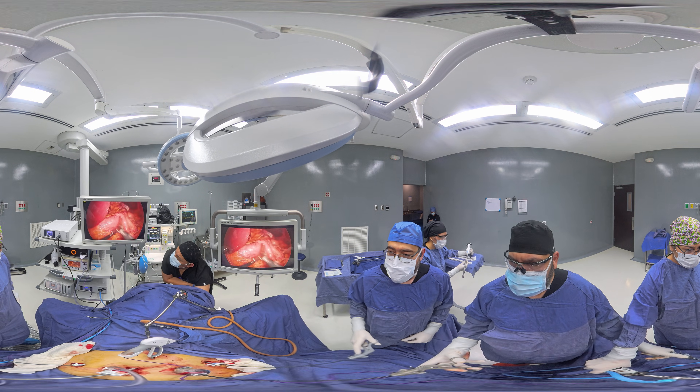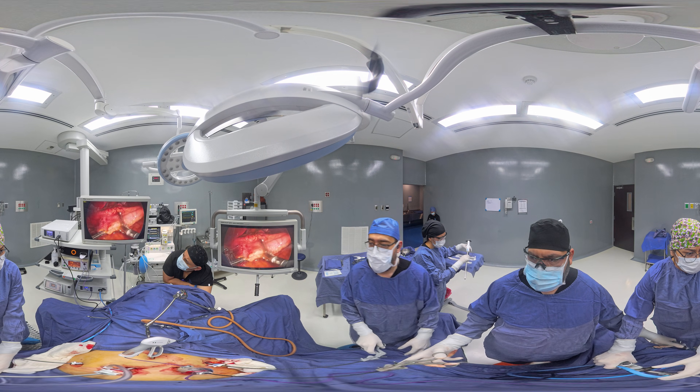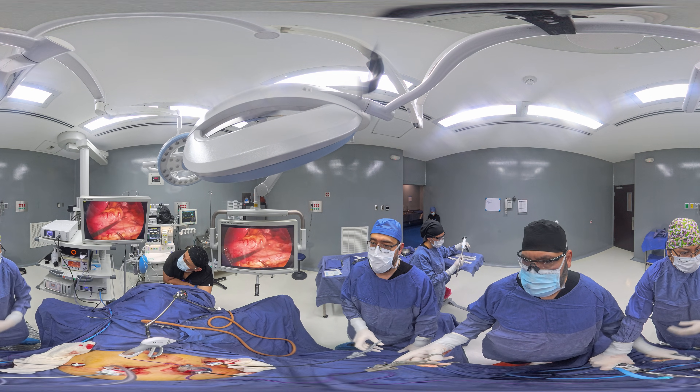Bougie has passed through. Now we're going to calibrate the sleeve.